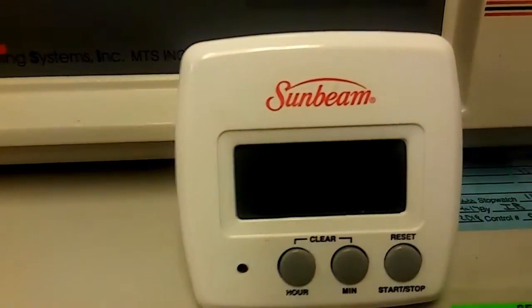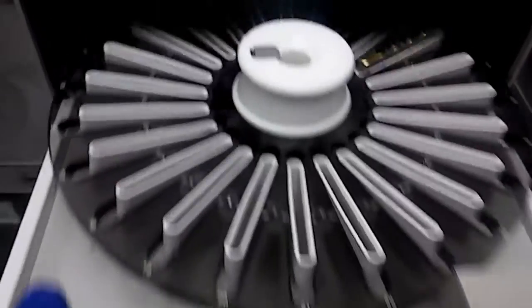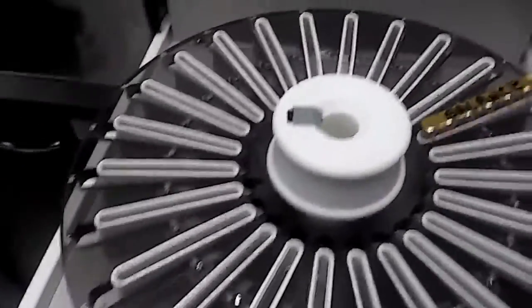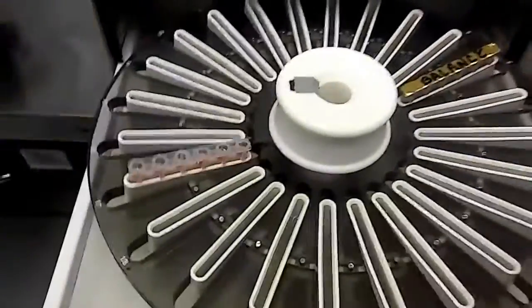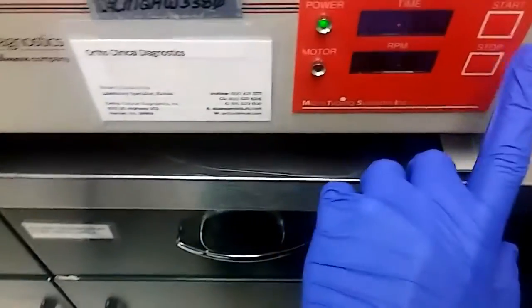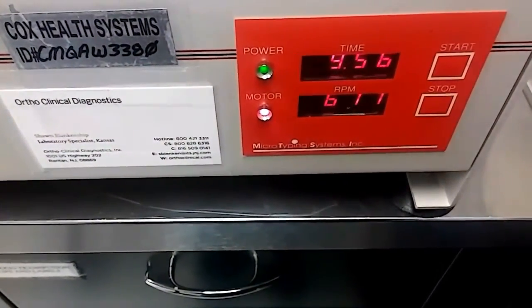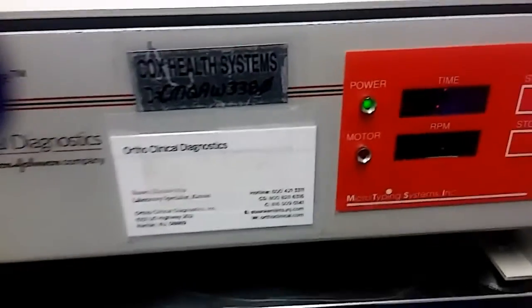After that, we will put it in our centrifuge — it looks like this — with the balance card. Now that the 15 minutes are up, we're going to take our card and place it directly across from the balance card. Push it close, then press the start button and it will centrifuge for 10 minutes. The centrifuge is done, now we can take out the card.